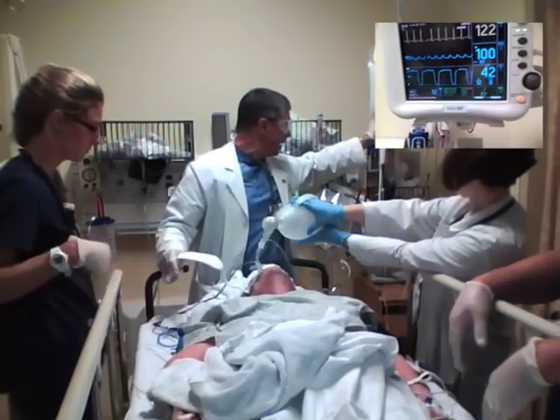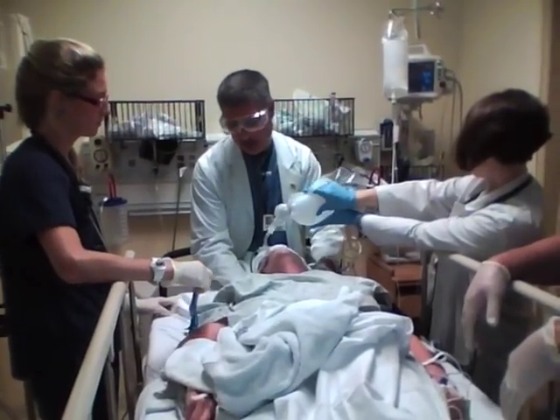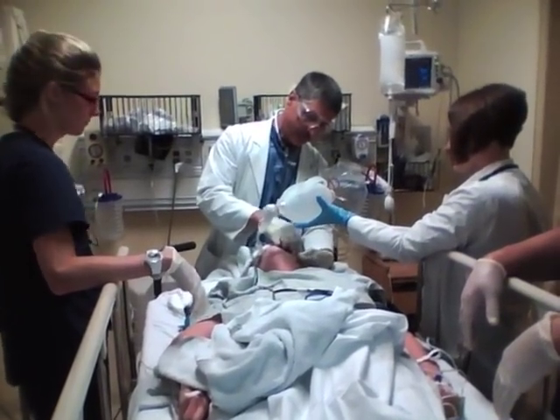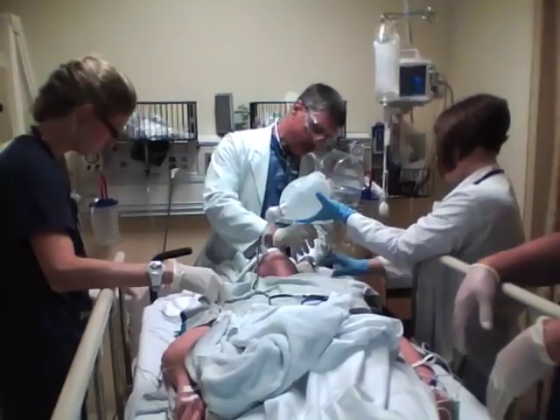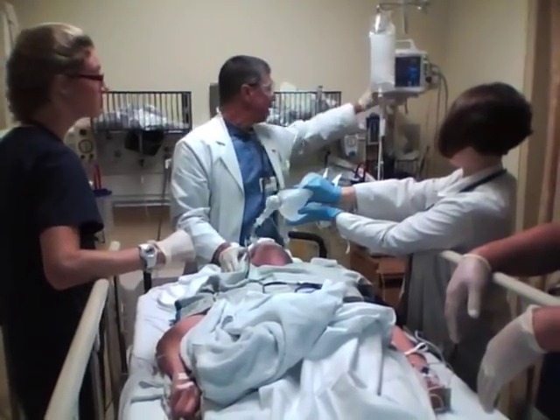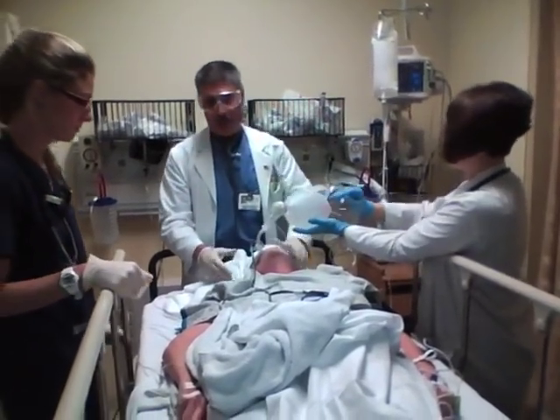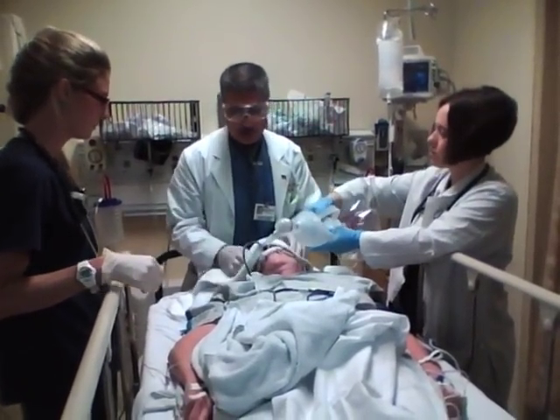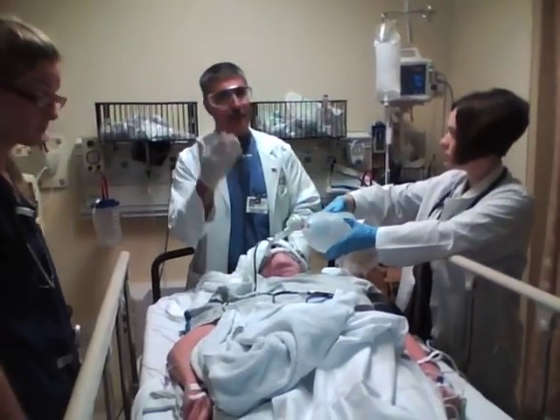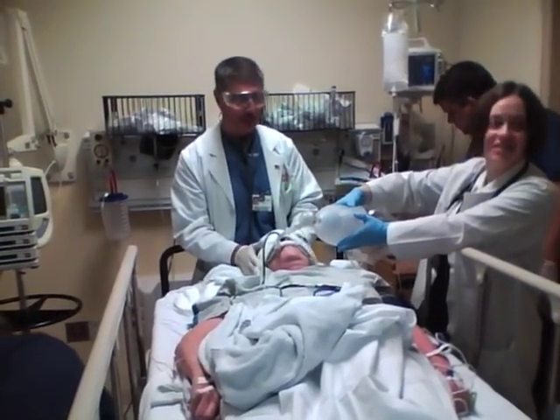By reading the actual numbers on the capnometer, the team knows exactly how much to ventilate her — so we're not hyperventilating her and we're not hypoventilating her. Tube is in place. We've got good breath sounds on both sides. Her pulse ox is 100% — she's a little tachycardic. We're going to repeat her blood pressure. With ketamine on board, her blood pressure should be pretty good. We'll get a chest X-ray to confirm position, and now we can bring respiratory therapy in with the ventilator.